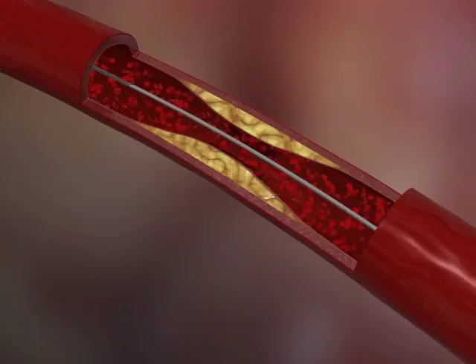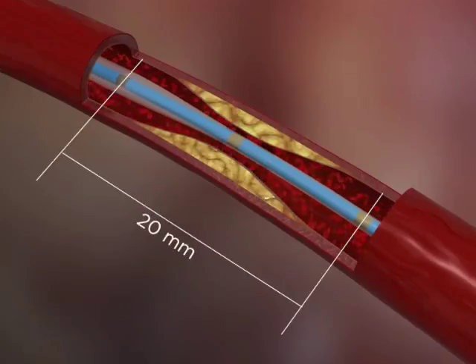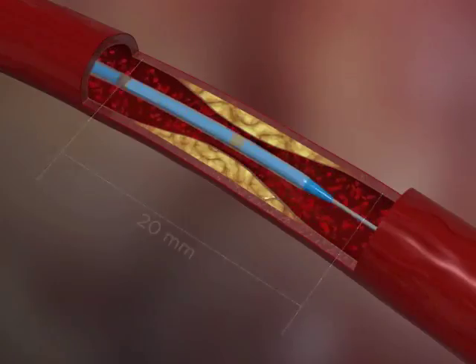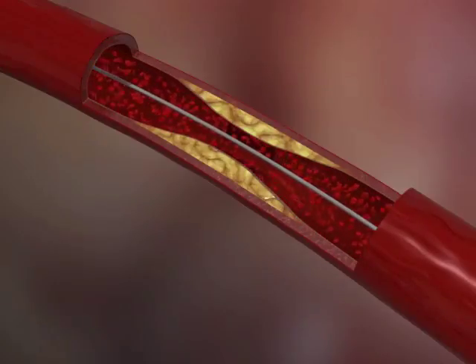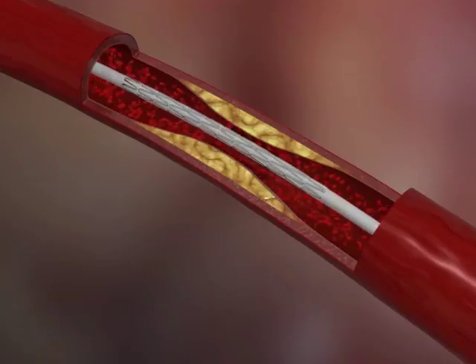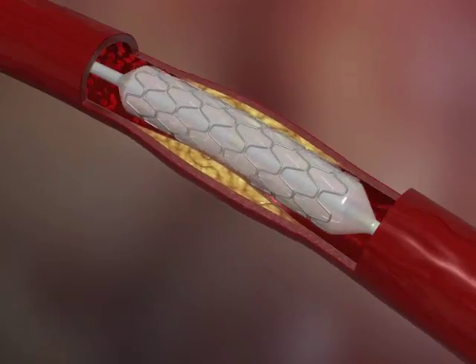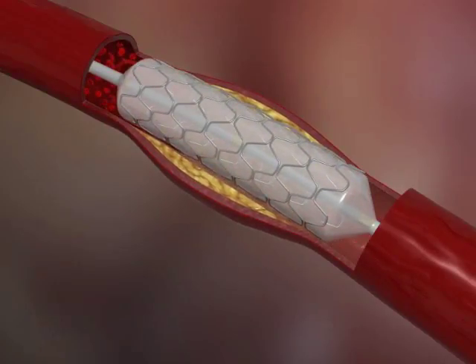The size of the stent to be implanted can be determined thanks to the catheter's radiopaque markers and viewing of the vessel. The preparation of the artery with the Amicath allows direct stenting to be performed without predilation with a balloon catheter and the risk of distal embolism. It also makes it possible to determine the need for thrombus aspiration prior to implanting the stent.